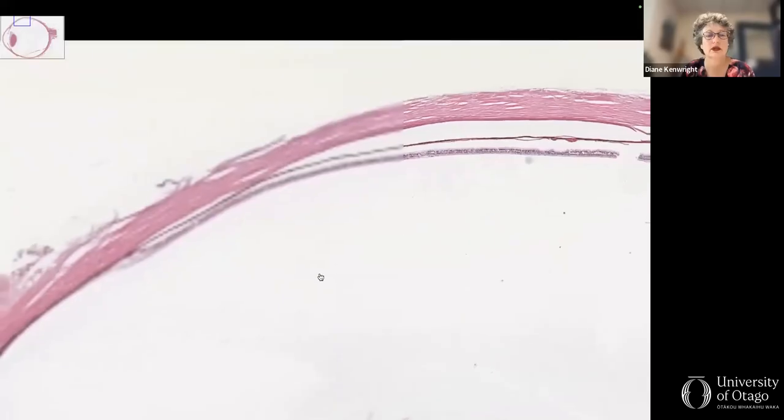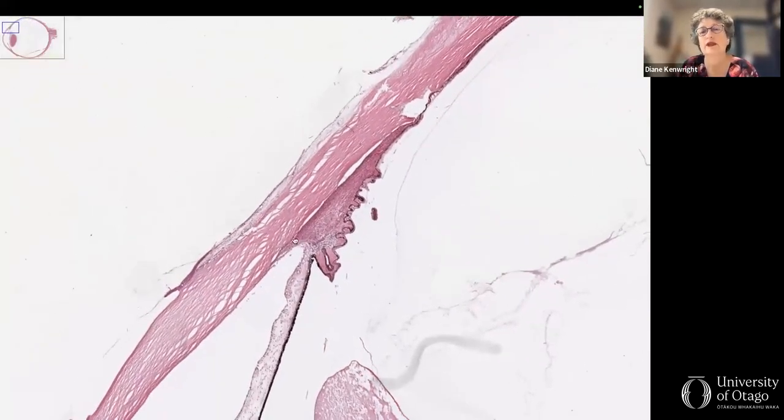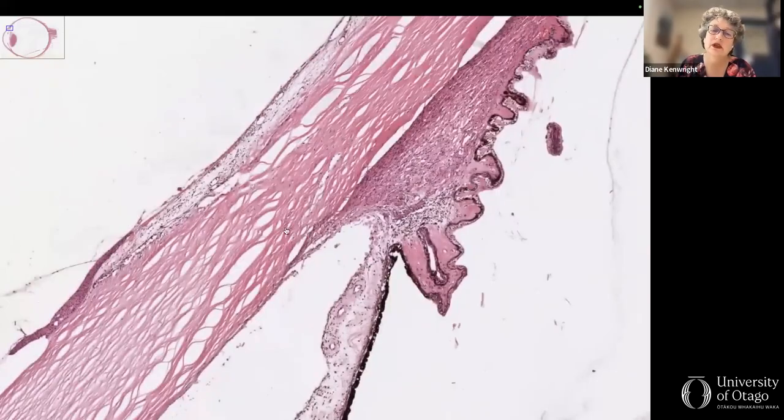Okay, so this was phacolytic glaucoma. We'll head over to the other side here. And again, we can see the angle is open with the trabecular meshwork just through here. But again, these macrophages. Okay, that's the end of that recording.